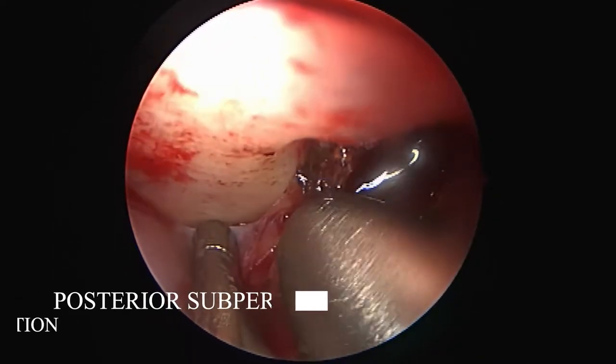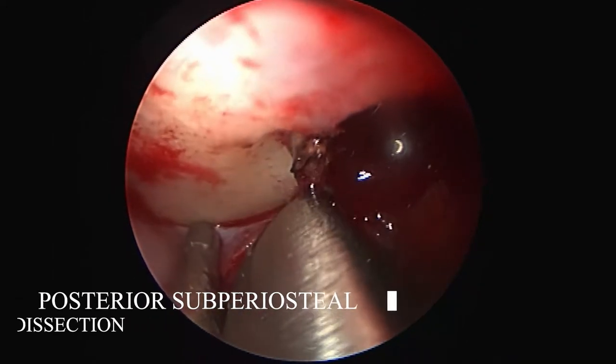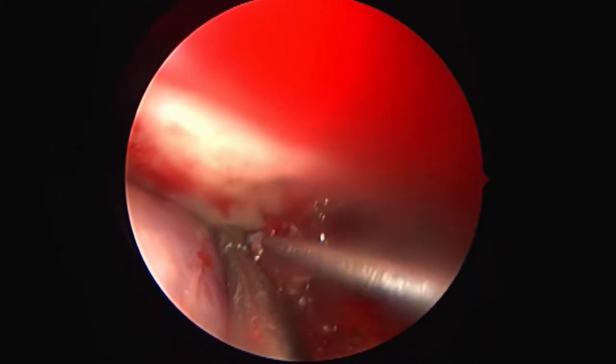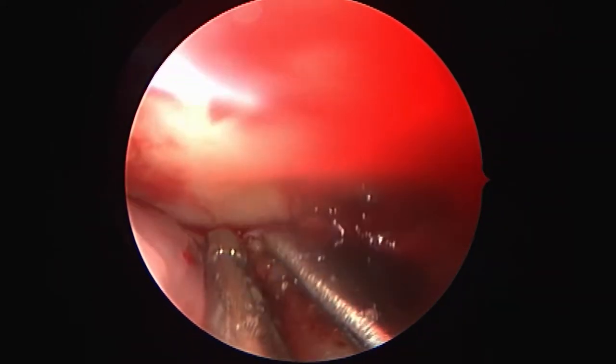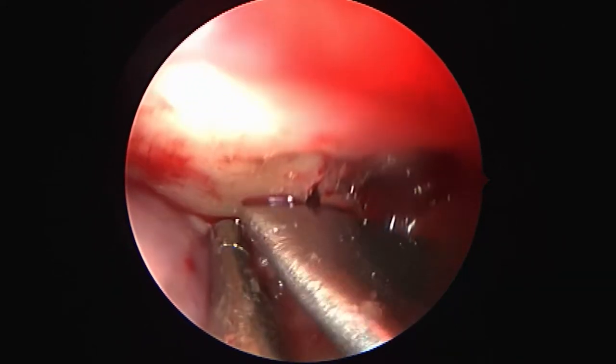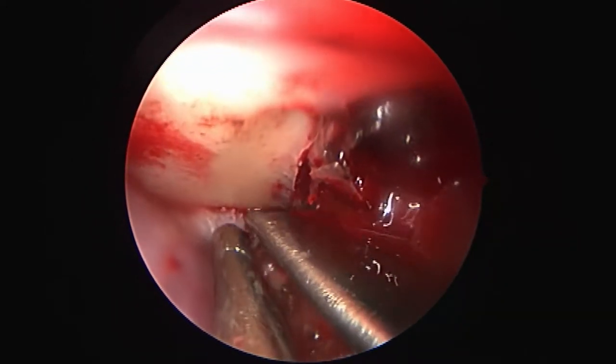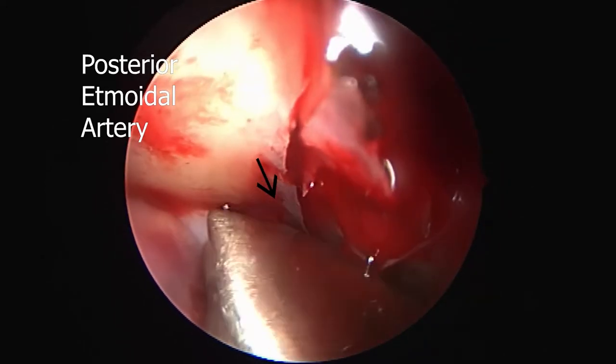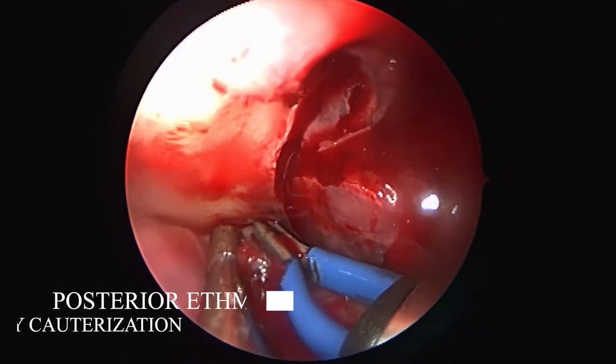Our next step is the subperiosteal dissection towards the posterior ethmoidal artery. Once visualized, we cauterize it similarly to the anterior.